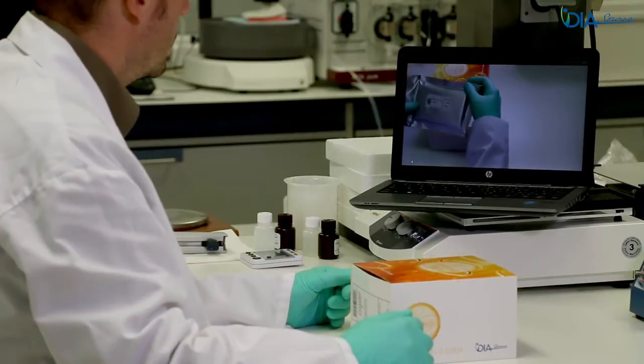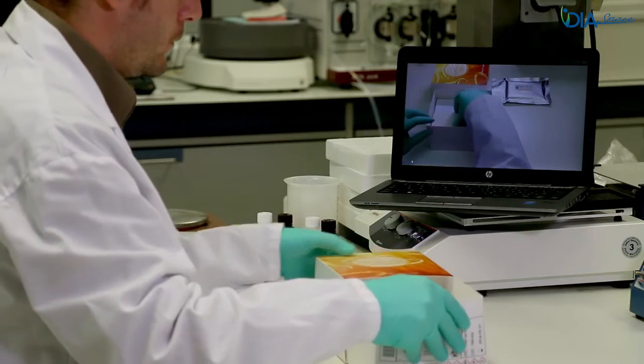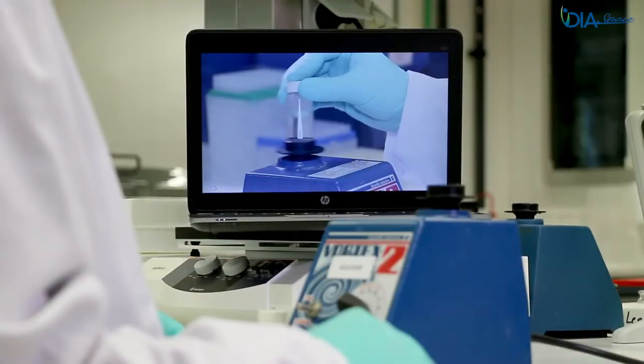This video has been specifically designed to visualize the proper manipulation of the Diasource 1,25-dihydroxyvitamin-D ELISA assay in order to ensure good quality results.